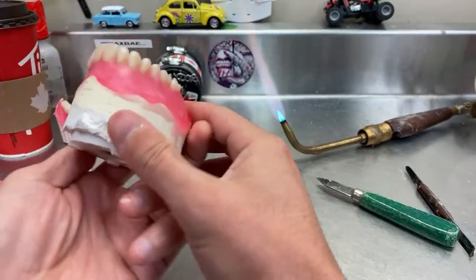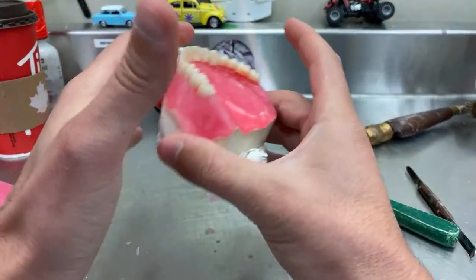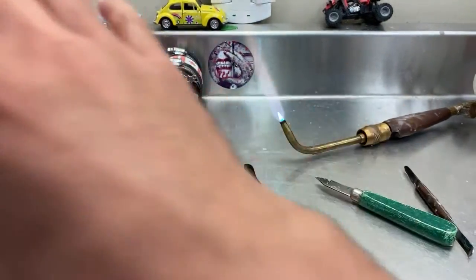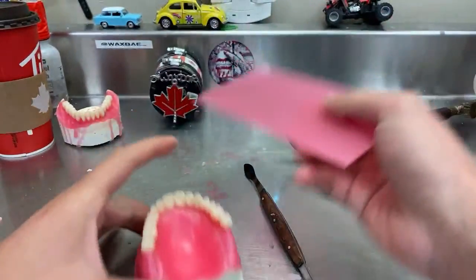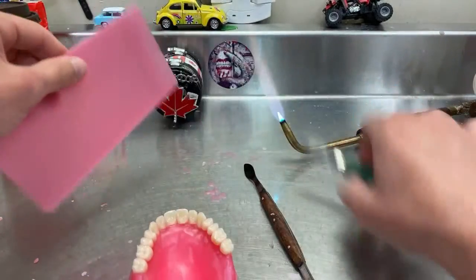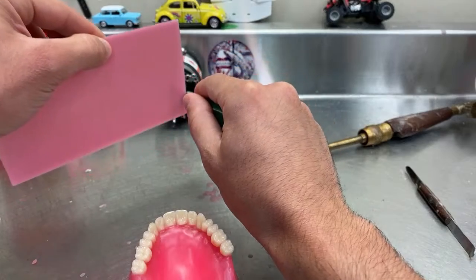Now it looks okay. It will still need more adding, but before I heat up this side very good, I have to work on this so the teeth don't move. So another wax addition here. We add more. Same thing.